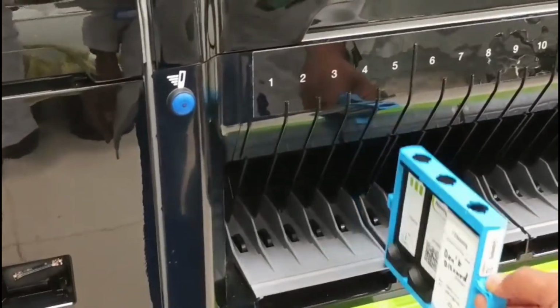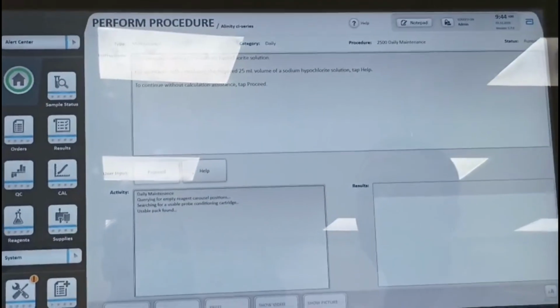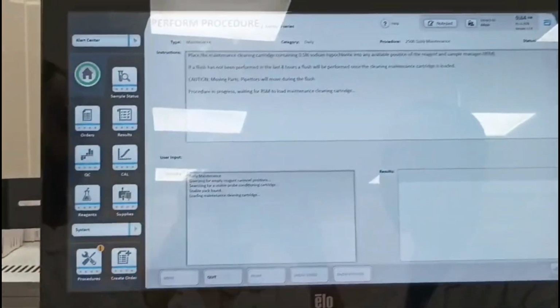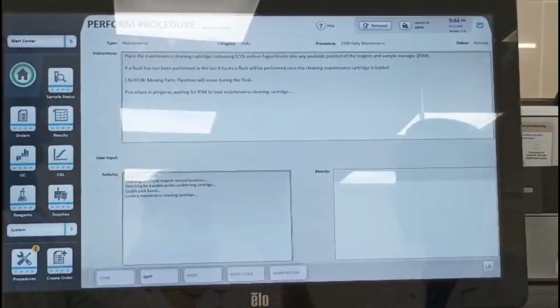It's right? Yes. Finish. See. And again proceed. One more proceed, three times. Now it's going inside. Okay, so you can start maintenance solution.